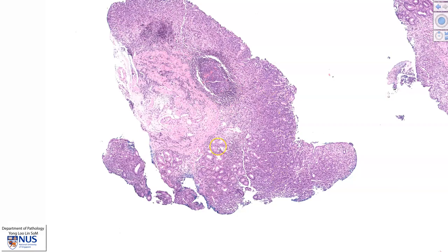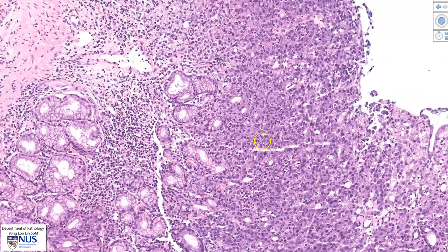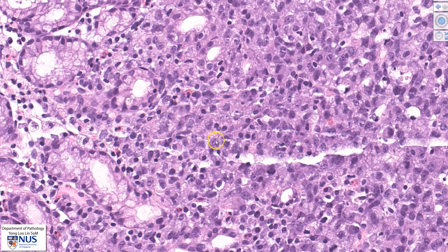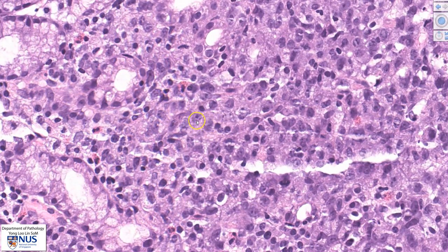Looking at another piece, I am again going to focus on this area where we see a disruption in the glandular architecture. Here are sheets of malignant cells that do not have an obvious signet ring configuration. However, we know that they are malignant because of the irregular nuclear membranes, prominent nucleoli, and also the fact that they form these invasive sheets within the lamina propria.